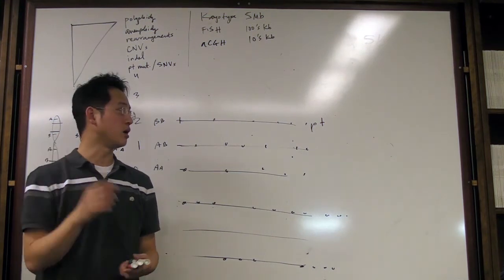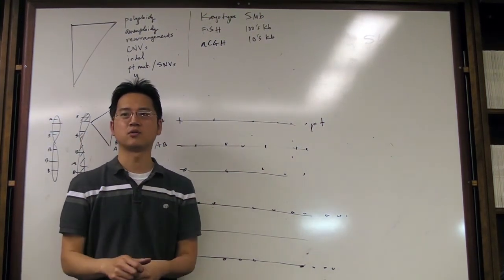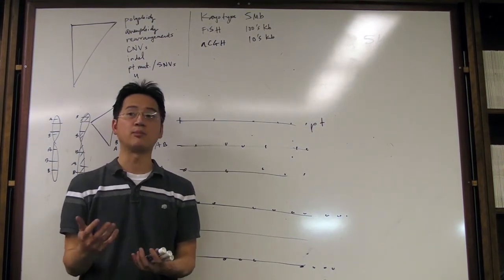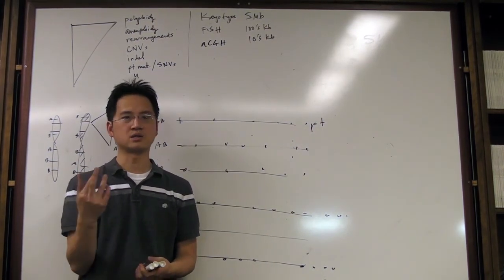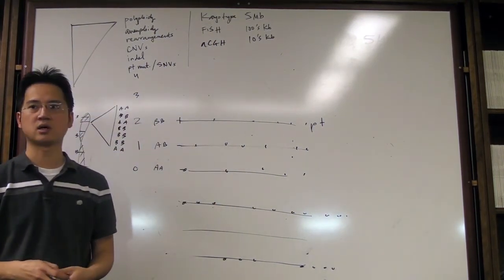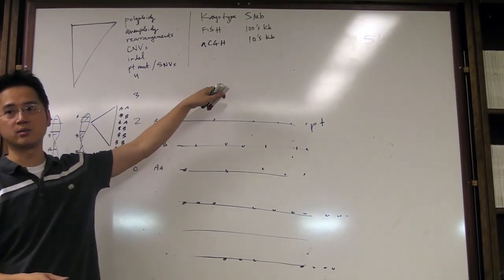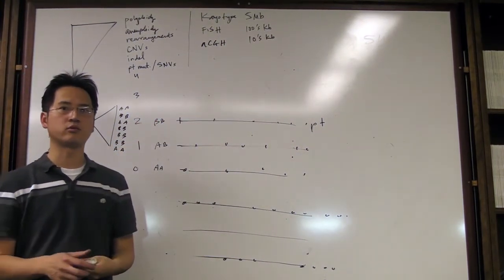So we've run our assay. So far we are just completing, I think, the validation for the UPD, but we've picked up a couple of cases where there were cousin-cousin marriages that show loss of heterozygosity. So this, in combination with aCGH copy number detection, gives you a rather powerful technique.